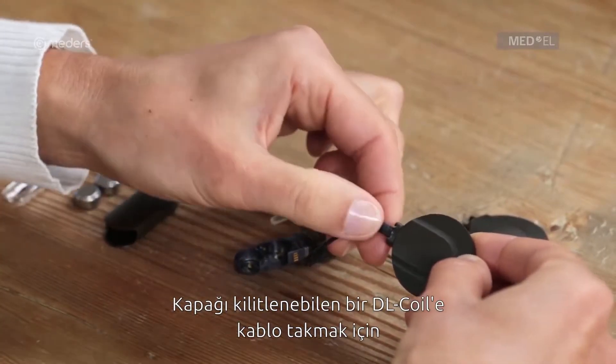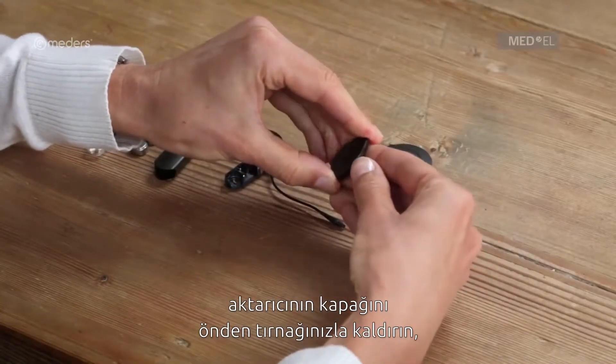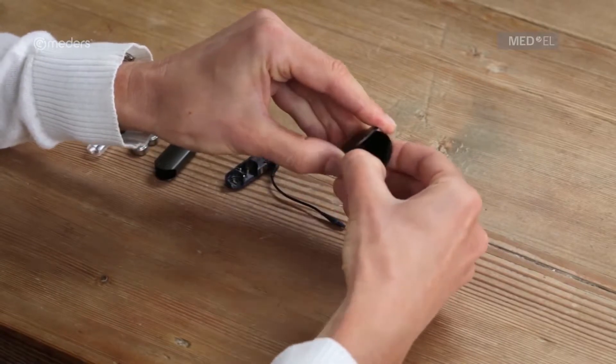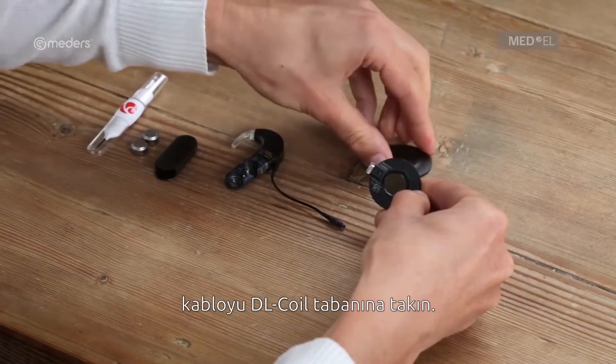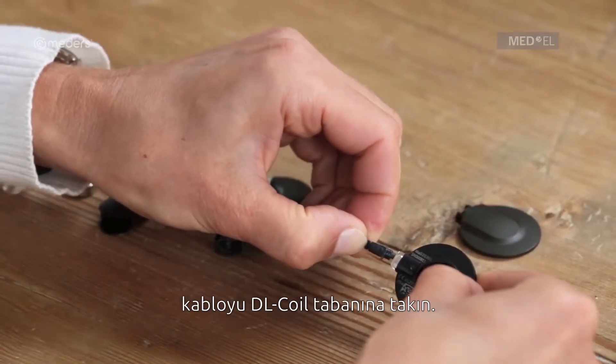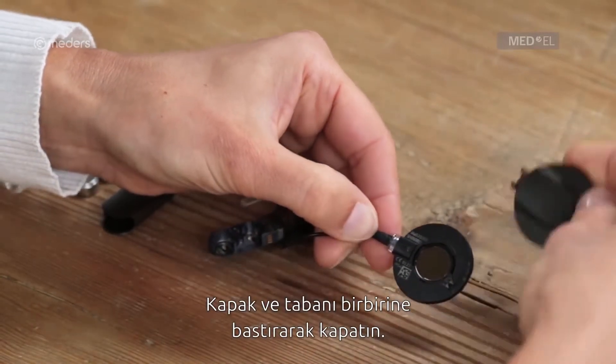To attach the coil cable to a DL coil with a locking cover, remove the coil cover by lifting the cover from the front with your fingernail. Plug the coil cable into the DL coil base with the logo and arrow on the coil cable plug facing up, and close the cover by pressing the cover and base together.